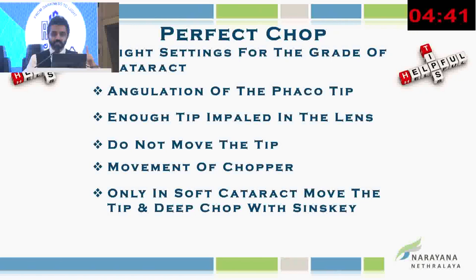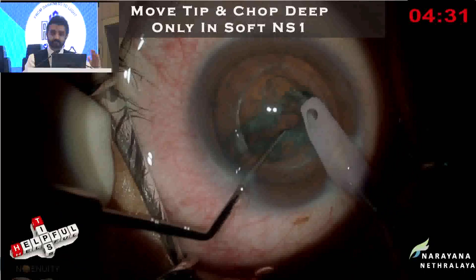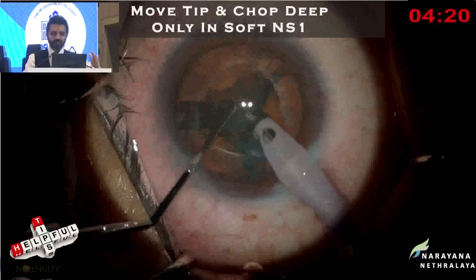This is very, very important thing. So as you can see, this is a very soft cataract. I make a very deep chop towards the tip, and I move it very slowly sideways, so the chop happens. Yes, in soft cataracts, you can still do a direct chop. It's just about the technique. It's more of a mechanical thing. I'm not using too much vacuum. It's under irrigation itself. And you can see the chop happens every single time.